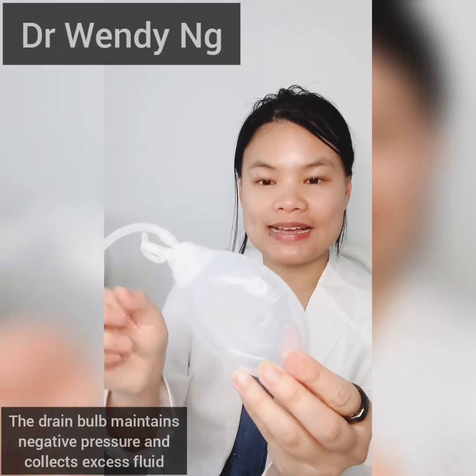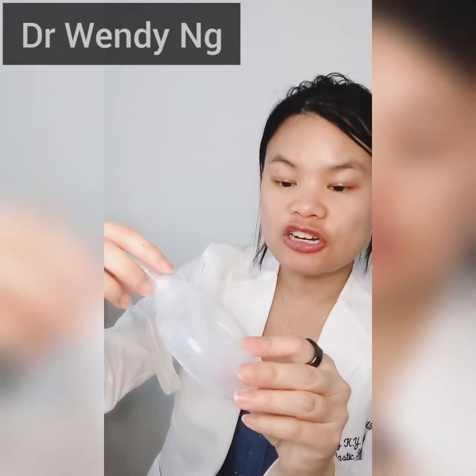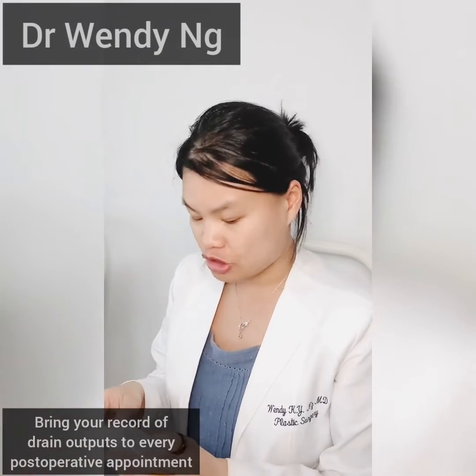The fluid collects inside the drain bulb. There are small markings all along the side of the drain bulb. After your surgery, make sure that over every 24-hour period, you write down the amount of output coming from your drain on your record of drain outputs.